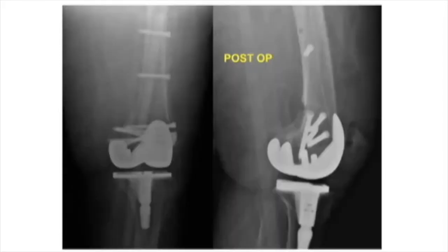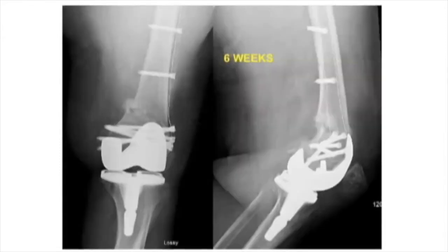There's just too much stiffness in the environment, you can't handle it. This may be the solution. This may be the balance between, okay, you know what, we can hold the reduction, we can still put in a lock-in implant, particularly in osteoporotic bone, such as this patient, poor biology, still get good robust callus formation at 6 weeks. If I had done this with a metal implant at 6 weeks, I probably would not have seen as great callus formation as I had with this.